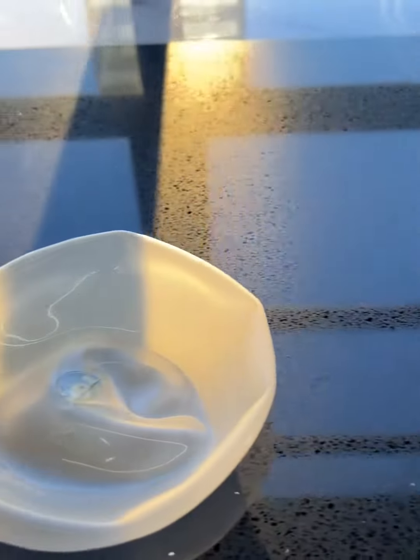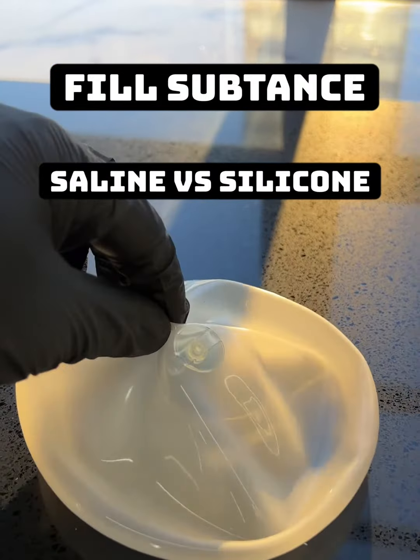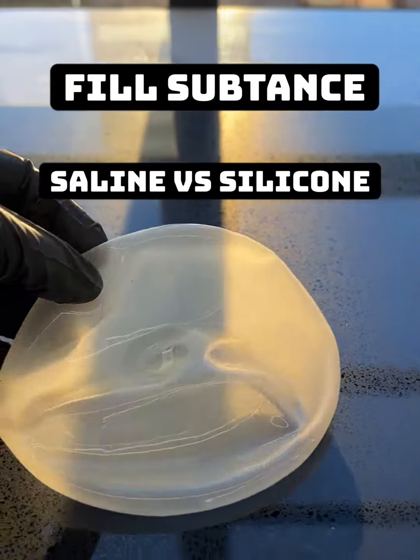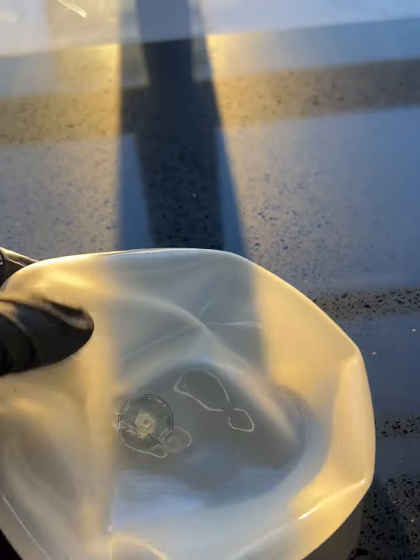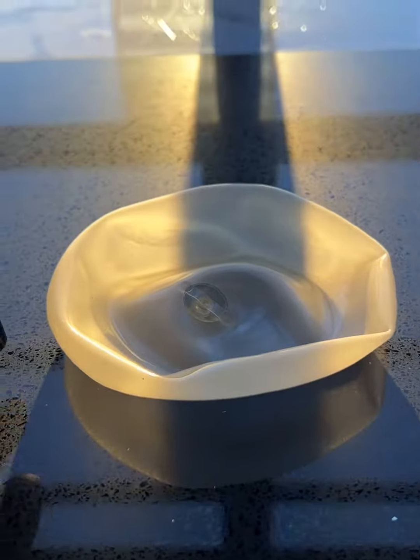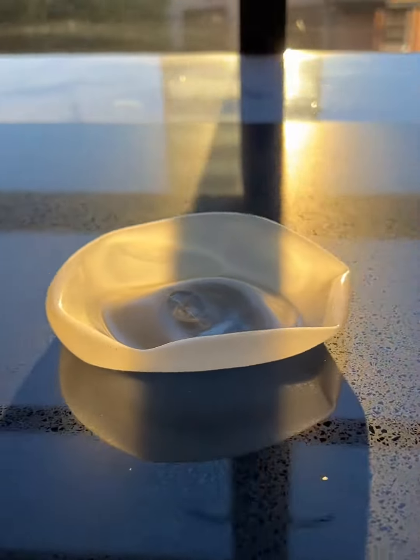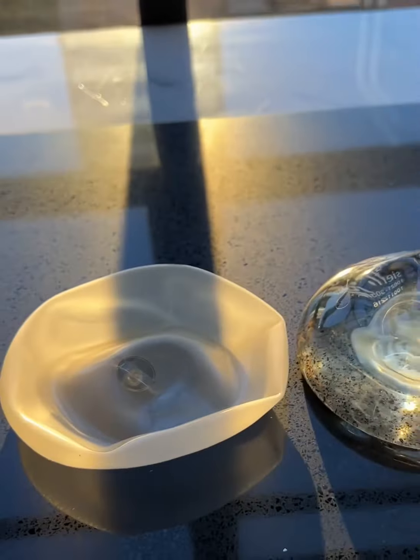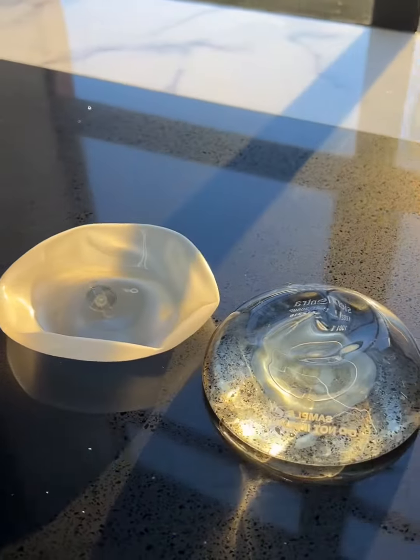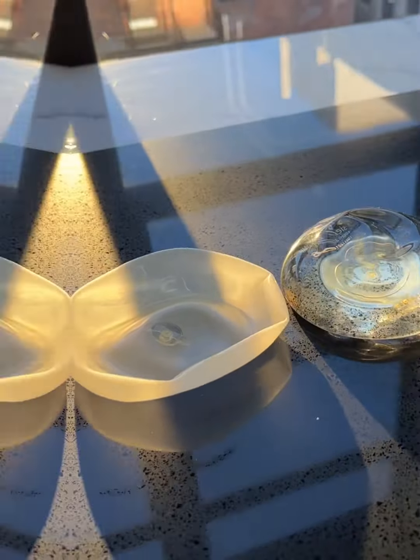Another variable is fill substance. This is a saline implant. Here is the tab that allows us to fill this silicone shell with saline fluid after it has been placed inside of the patient. This allows us to use an even smaller incision. However, some downsides are that if the shell ruptures, the patient will be noticeably flatter on one side. Also, the feel is not as bioidentical as a silicone gel implant.